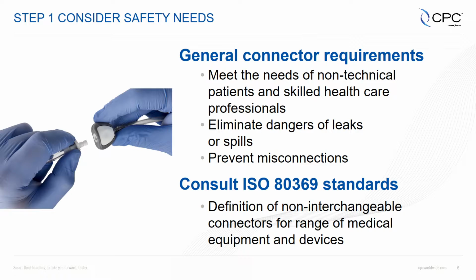We also have to make sure that we eliminate the dangers of leaks or spills. Now, a leaky connector can be a nuisance. For example, on a cold therapy device, you fall asleep and you have a leaky connector and you wake up in a puddle of cold ice water because the compression therapy device has a leaky connector. But on the other hand, it can actually be a danger or a hazard. Now, imagine a leaky connector spilling water or some sort of slippery fluid on the floor, creating a slip or fall hazard where someone could actually be harmed or hurt. So the leak-free performance is key to making sure we have a safe connection.